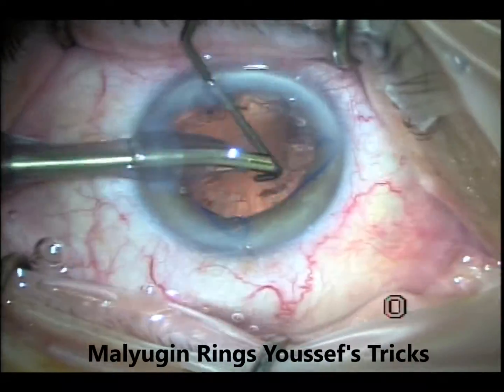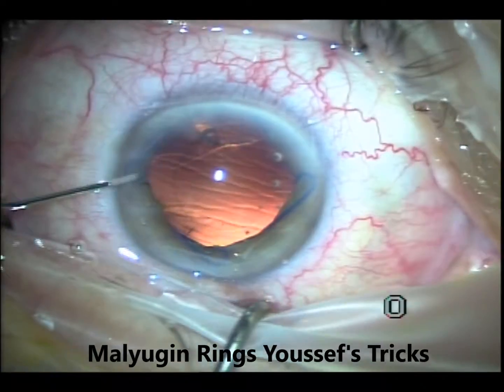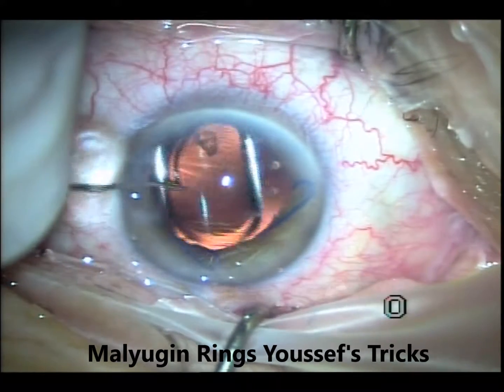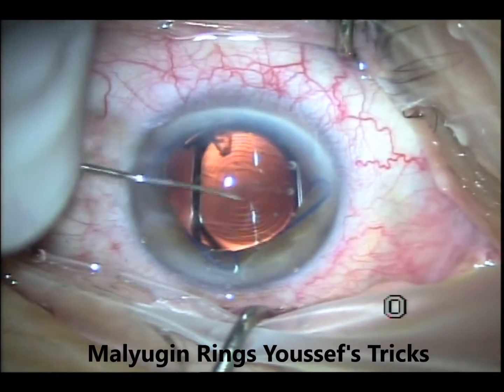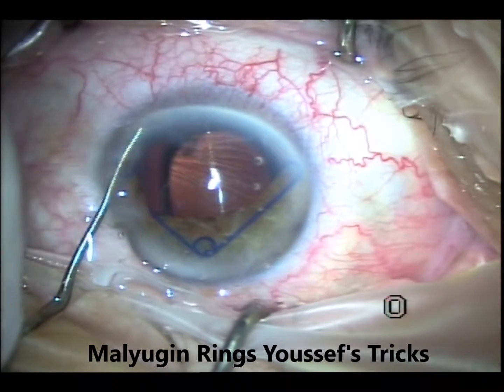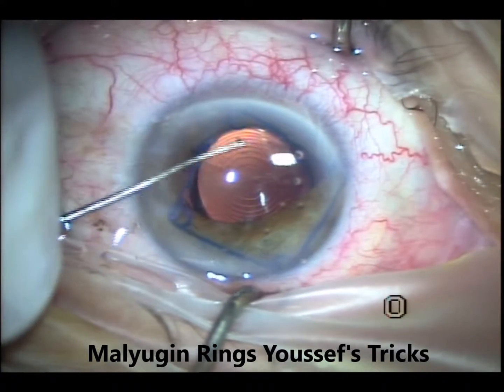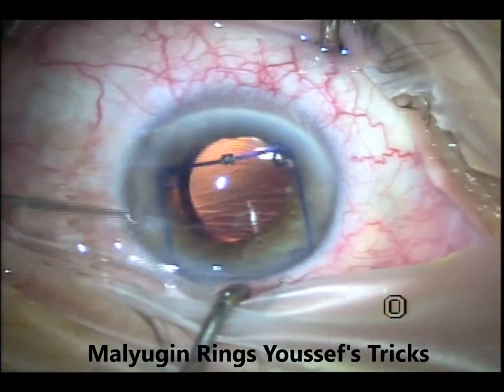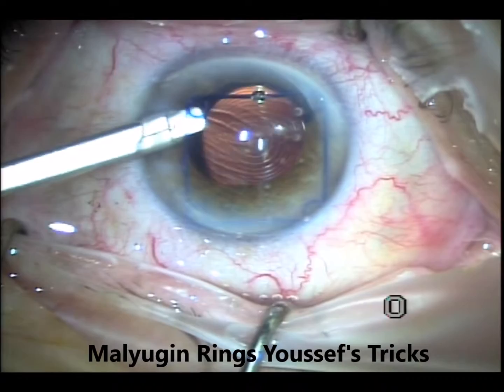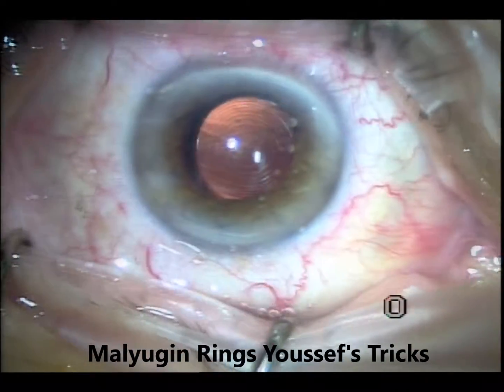Then just routine cataract — J-cannula, cortical cleanup, viscoelastic, lens. Then I'll remove the ring again. I'll remove the right one first, and then from the bar between the superior and the temporal one, I'll remove the sub-incisional ring, and then drag the last one so that I put the one that was superiorly into the area of the incision so I can engage it with the injector.